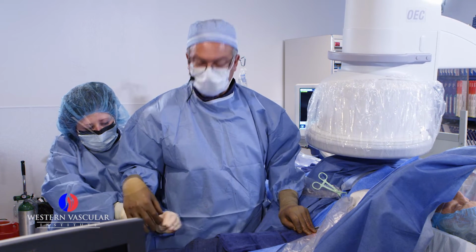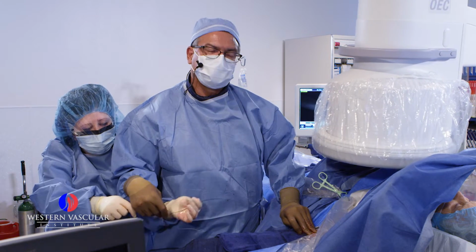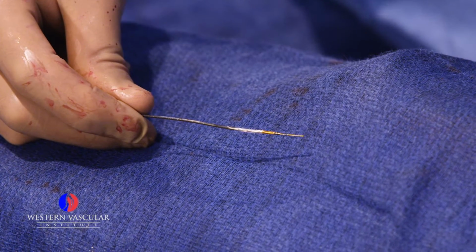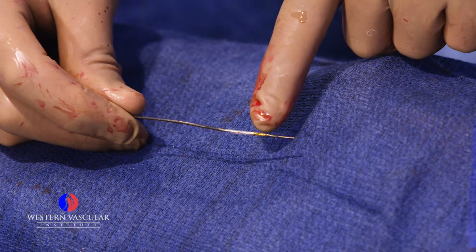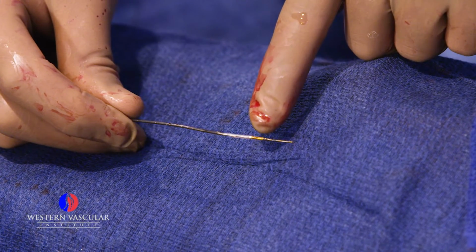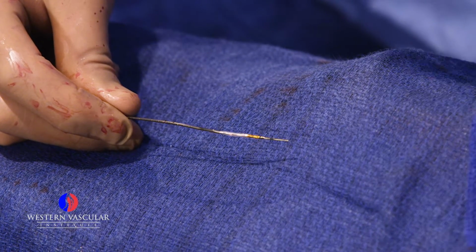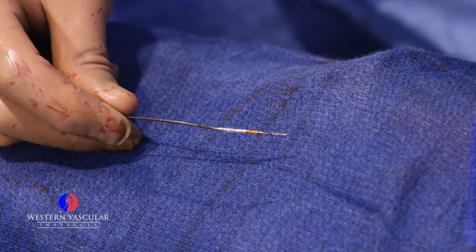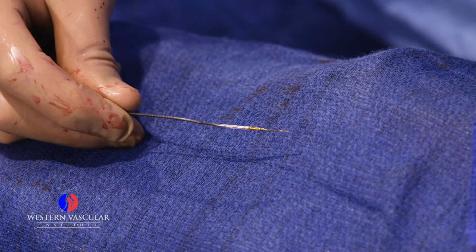It's a catheter that has the capability to show me the inside of the artery. It's a very tapered, very small device. Right in this area that is almost like a yellow color, there's a transducer. It's a technology that spins around and recreates circumferentially the anatomy of the vessel that you want to interrogate, or the vessel that you want to see.